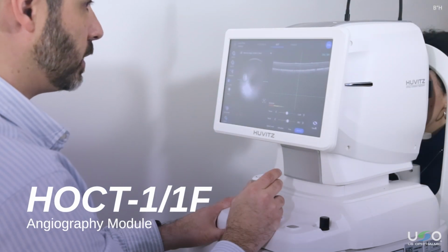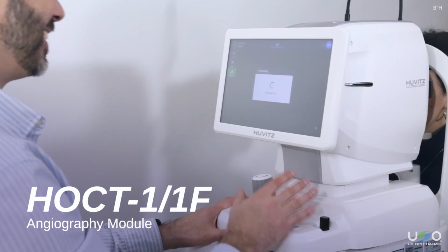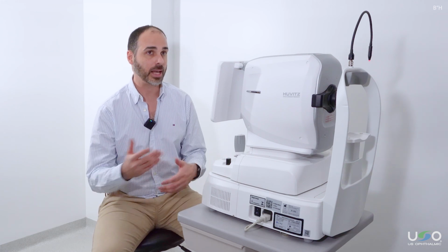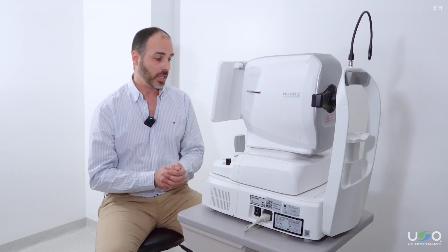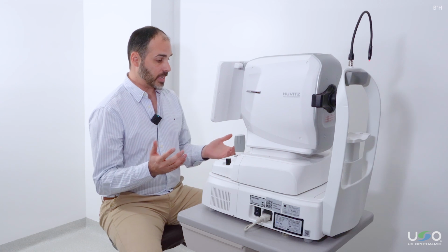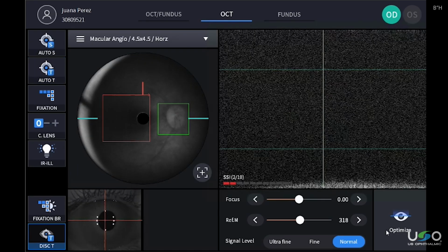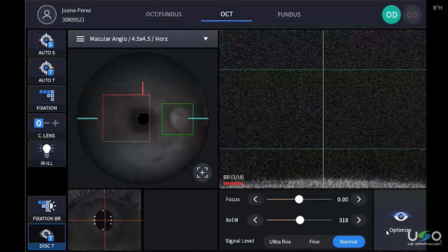One of the advantages of OCT angiography is that it is a non-invasive method. So we no longer have contraindications associated with pregnancy, cardiac or renal problems. It isn't a method that has systemic effects either. In other words, it doesn't cause allergies or anything like that. Thanks to the hemoglobin reflex, it simulates a contrast element.